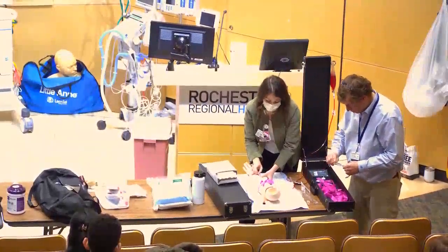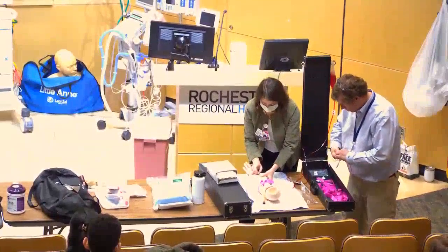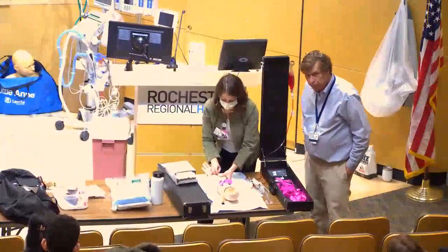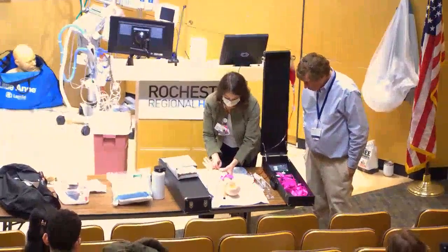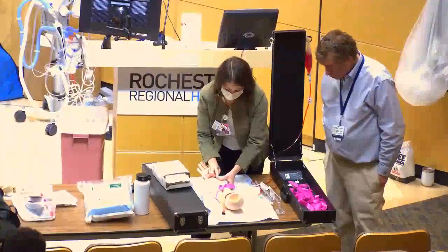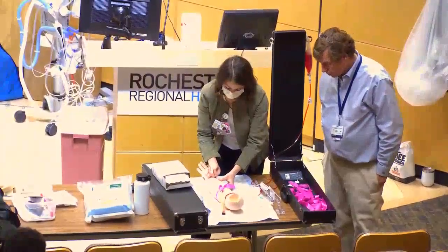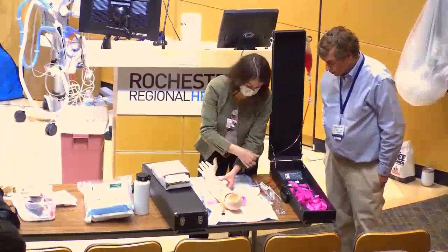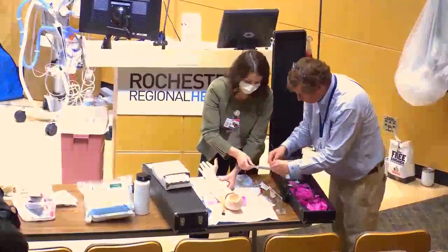Anchor below the vein because older patients' veins are often very rolly and don't stay still. Go in at a soft angle and insert. Once you get flash — you can see it on some mannequin veins but not all — don't insert the needle any further. Just advance the catheter: push the pink part up, advance it, and press the white button to retract the needle. Then remove your tourniquet.